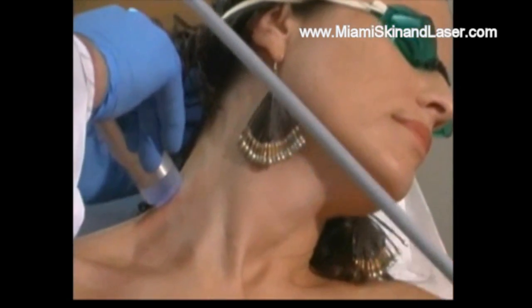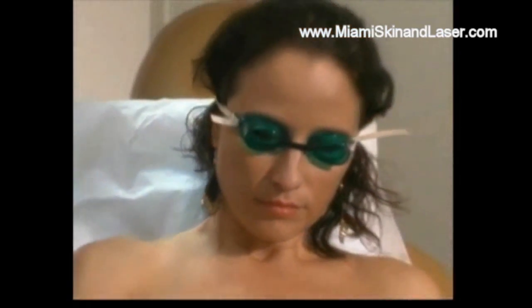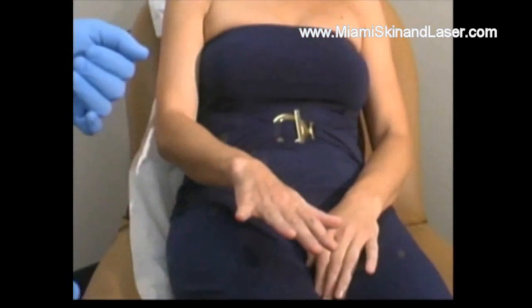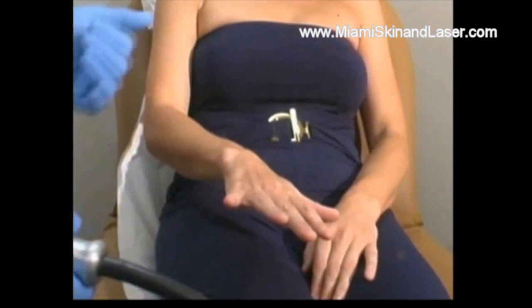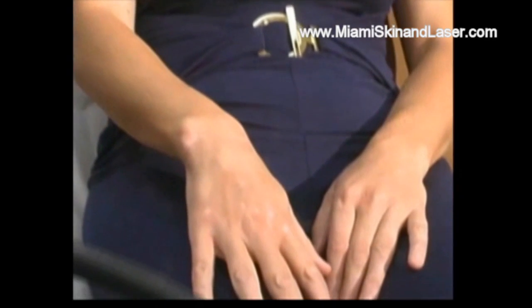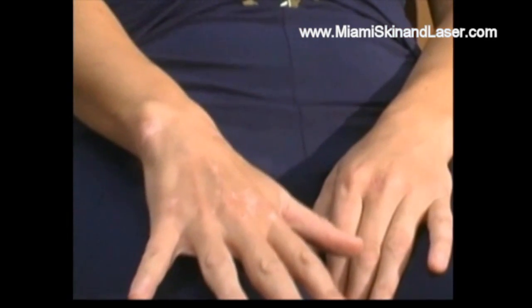We try to increase the energy on a session-by-session basis, but we don't want to increase it to the point where superficial blisters and burning can occur. There's no question that the skin is sensitive, but with proper adjustments of the laser, we can achieve optimum repigmentation.